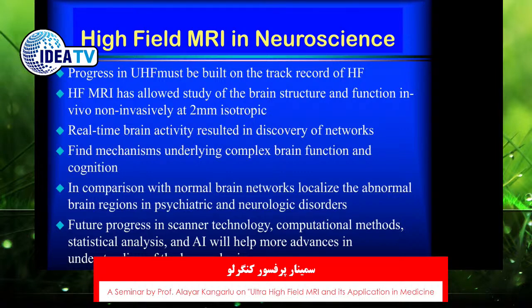can stay invisible. Now, because of the sensitivity, because of the susceptibility of a very high field, now we can detect cortical gray matter lesions. Perhaps the detection of the cortical gray matter lesions will help us solve the mystery of why there is, first of all, such a thing as relapsing remitting, why the patients start their condition with exacerbations and then they recover from it, and then they have these exacerbations.